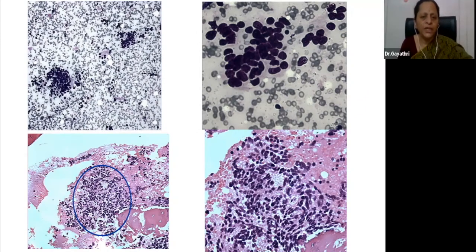Some cell populations can mimic lymphoid cells in the marrow. Where in the peripheral blood we saw variations in lymphoid morphology, in the marrow also, since everything in the marrow, I said, is round, there can be cells which are non-native but will mingle with the rest of the round cells that are native to the marrow.